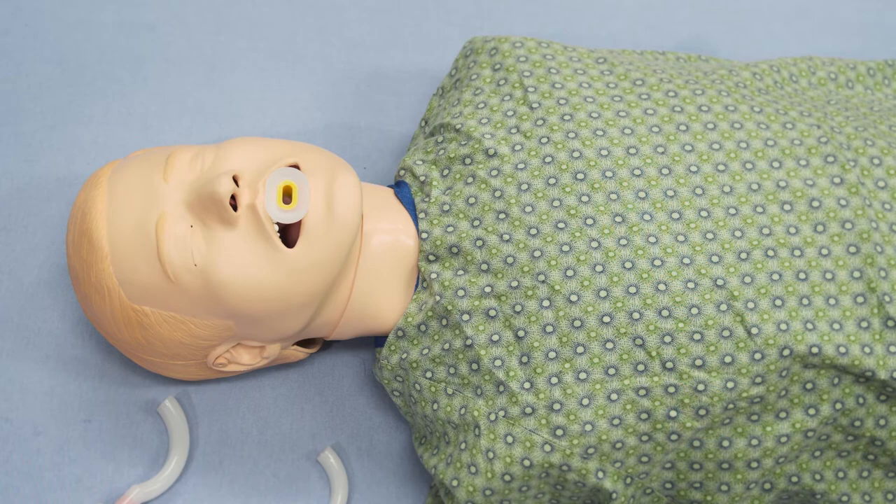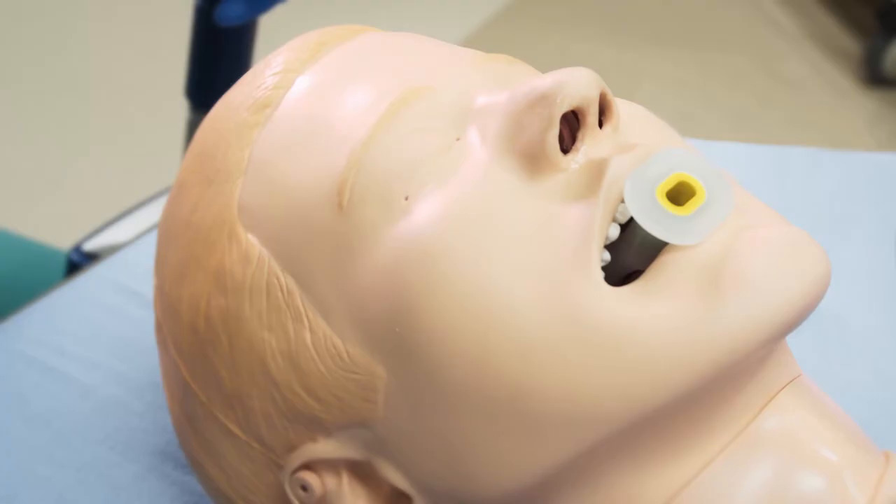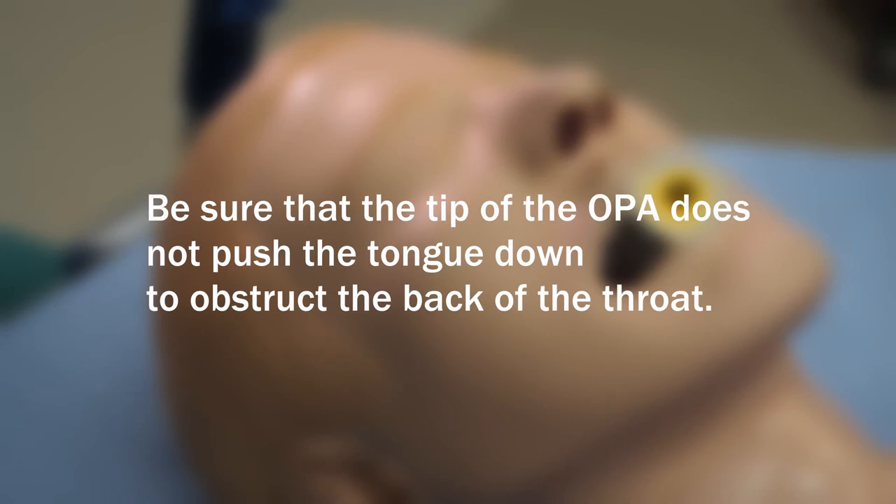Push the OPA all the way in, if necessary, so that the flange — the wide, flat end — rests on the person's lips. Be sure that the tip of the OPA does not push the tongue down to obstruct the back of the throat.